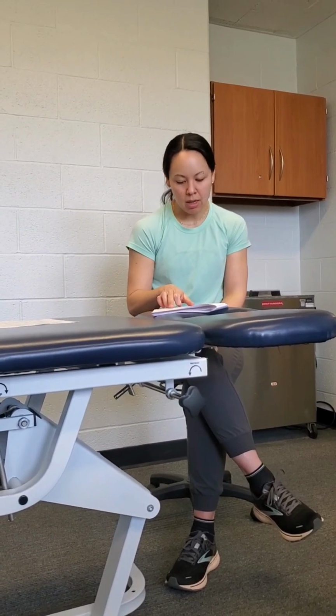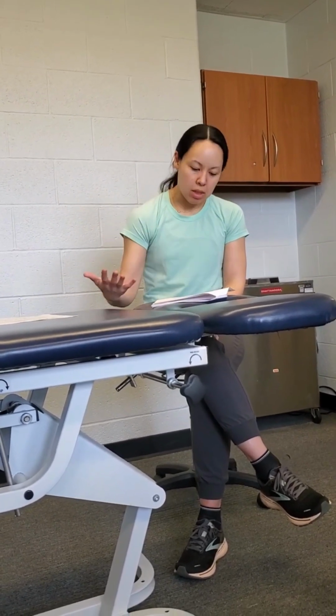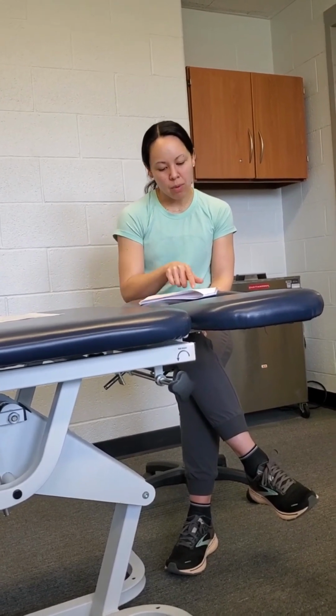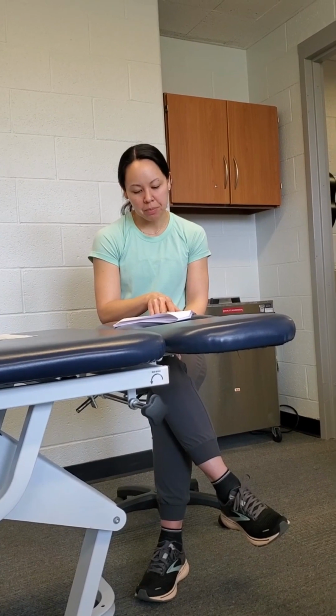And then as those numbers increase, you still have to inform the patient. You want them to relax for 5 minutes, recheck, and if they're outside of the range, if it's higher than 180 over 110, you're not going to do BFR, and you want to inform the MD. Exercise is contraindicated. That's right. So BFR would be too. I guess that's a good way of thinking about it, right?